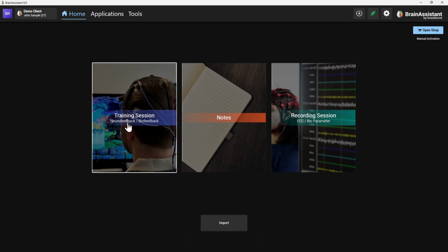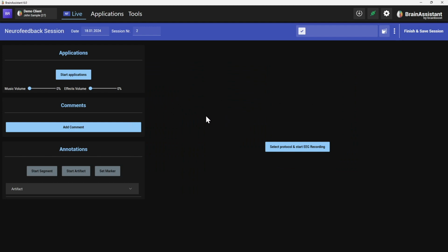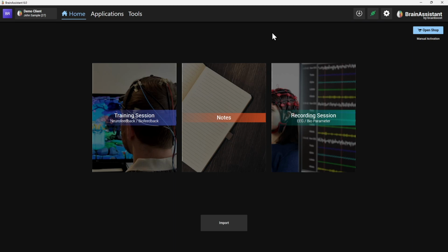But when you start, you can also start a flow. When you have a Mind Media device, you go on one of our connected protocols and press record, and then you start a training session like you would train. Here when you have a Mind Media, you see alpha, theta, high beta, etc. And here at the top, you can still start a flow and then finish and save. So you will not have the raw EEG, but with eyes open, eyes closed, certain tests or images, you will still see how the alpha theta amplitude behaves. And with CPT Stroop test, you still have commission, omission error, etc. So don't worry, you can still use all the flows with the Mind Media device.